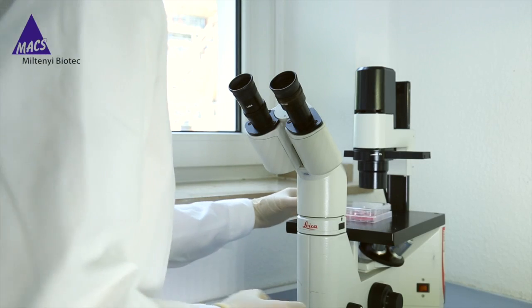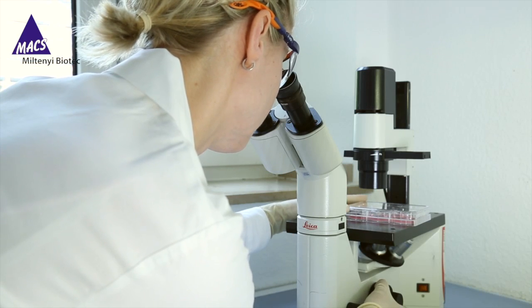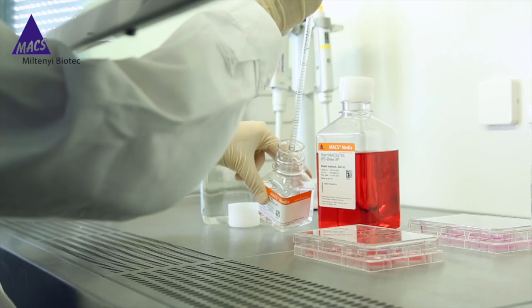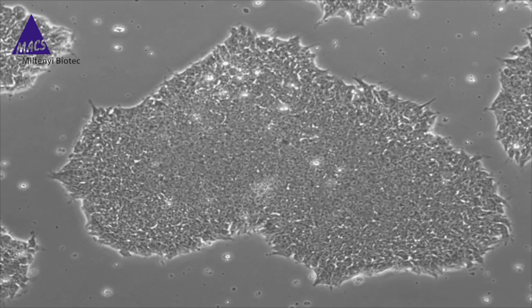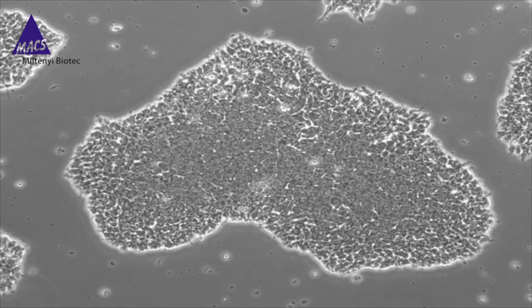After a visual check of the cultured cells, the media is completely removed, cells are washed once, and the StemMax Passaging Solution XF is added to the cell culture plate. Once the colony edges start to detach, the passaging solution is removed and replaced with fresh media supplemented with rock inhibitor.